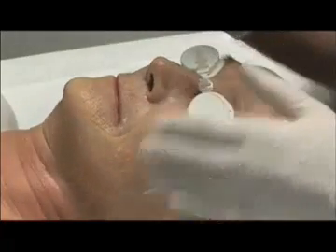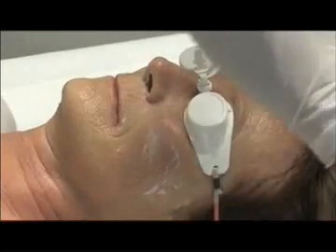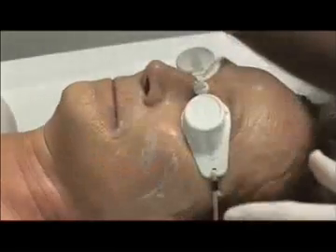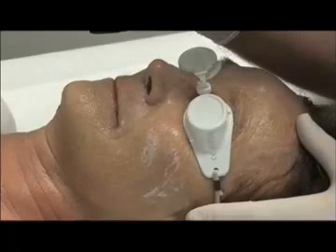We will advance at a certain rhythm, and if you want to, we can reduce the rhythm, and we can also have pauses. Do not open your mouth, as this will protect your teeth. If an impact hits the tooth, this will damage it permanently. Okay, let's start. I'm now moving along the upper lip.